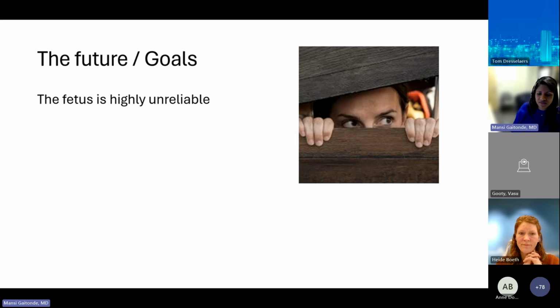So there is a bit of anxiety around that, but I think that is really the way to go. And I think there are some other centers who have also taken some very innovative techniques in terms of imaging, the cine imaging, and not relying on utilizing slices in the fetus, but imaging more of the heart as a whole. And that may also be something for the future that can eliminate our worries about the fetus moving in and out of the planes that we need.